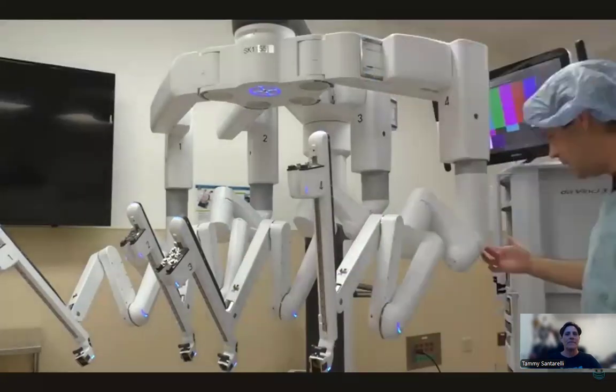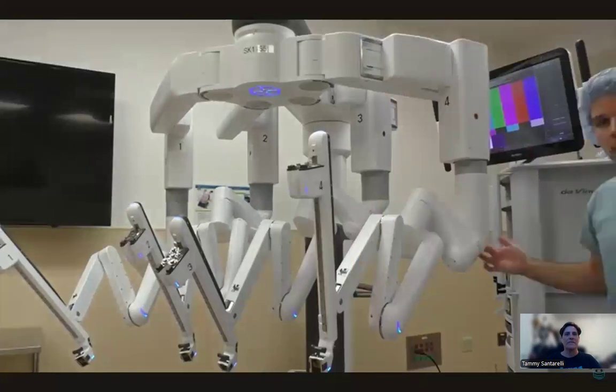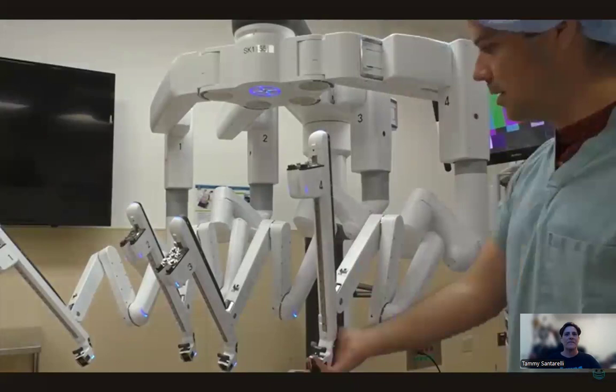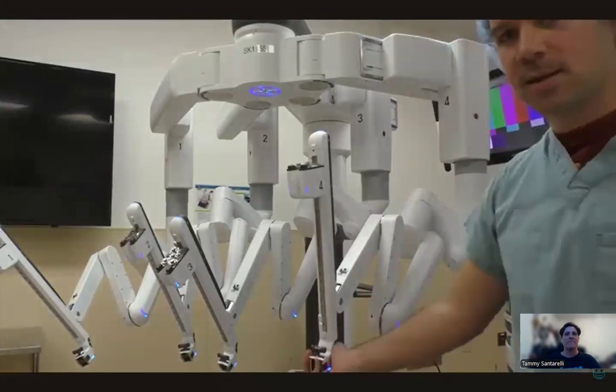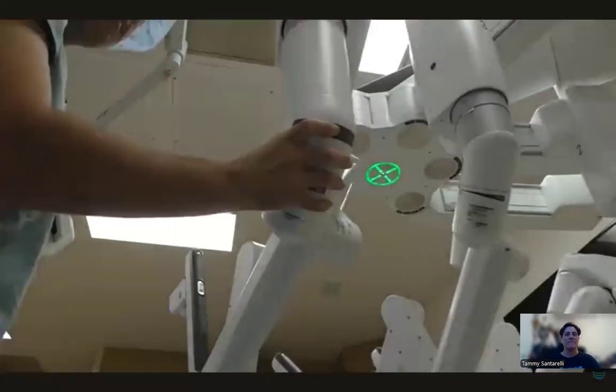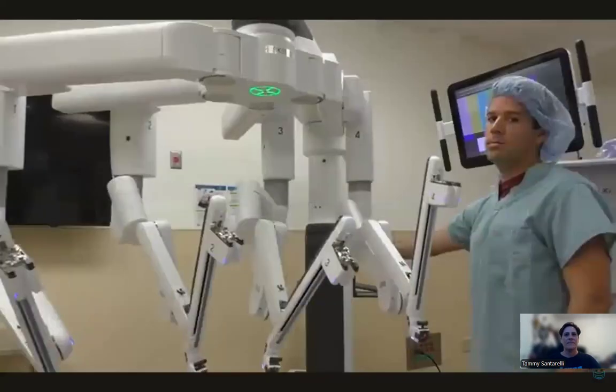So we have a button right here on the back of this arm shoulder. I like to call it the shoulder. I like to call this the elbow, and this is kind of like the hand. So if we hit this button and hold it itself.